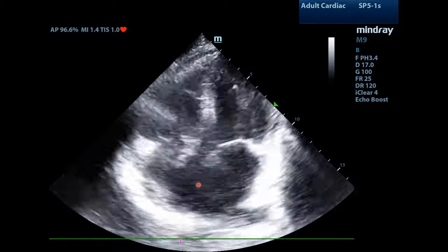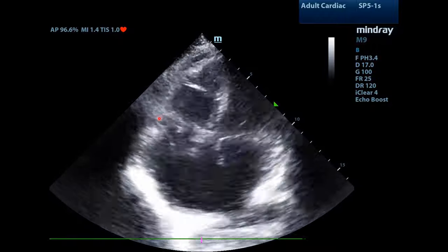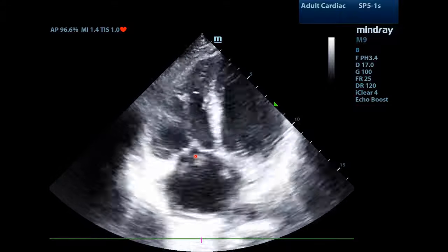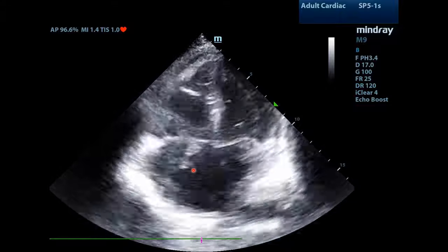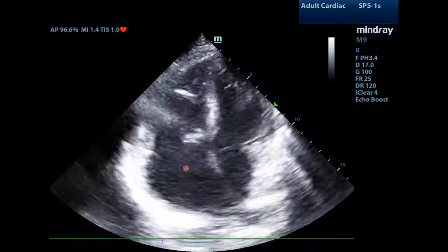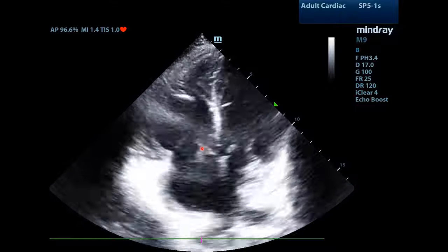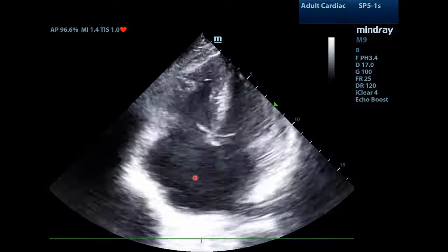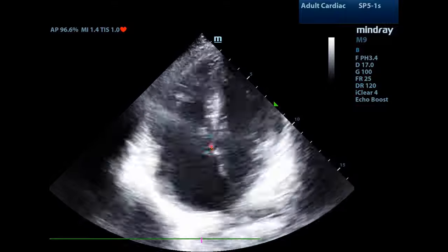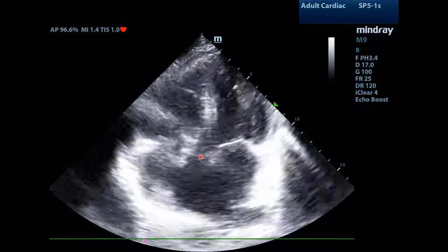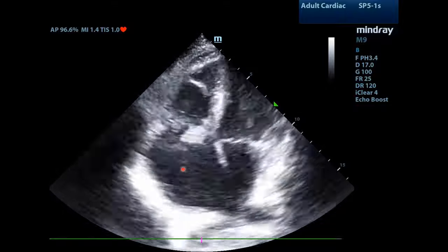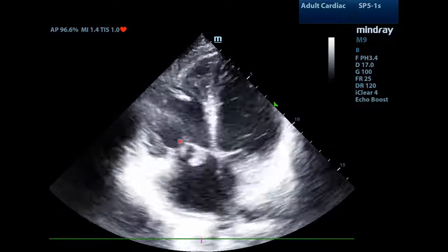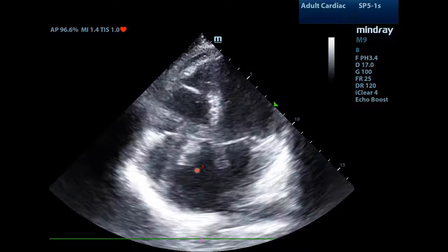We will now move on to the apical four-chamber view of the heart and focus on the tricuspid valve. Here we see the previous vegetation. Vegetations are typically irregularly shaped, mobile, causing regurgitation, and are typically found on the low-pressure side of the valve. Typically when you're looking at a vegetation, it should be seen on the low-pressure side, also known as the upstream side. So if you're worried about the tricuspid valve, it would be found on the right atrial side of the valve.